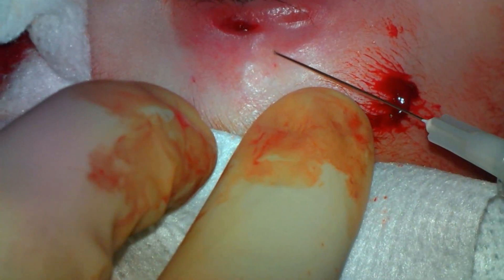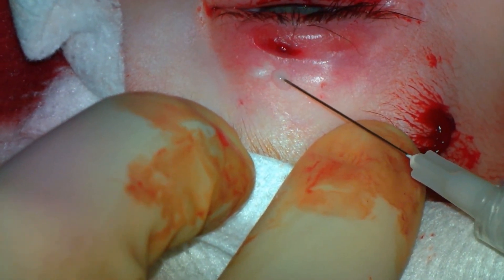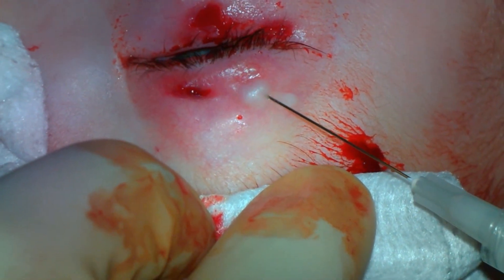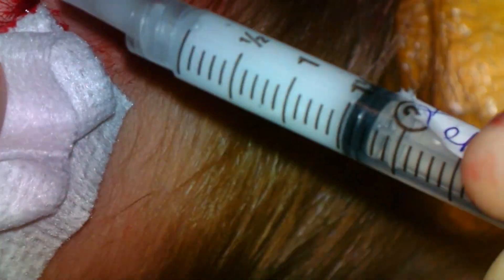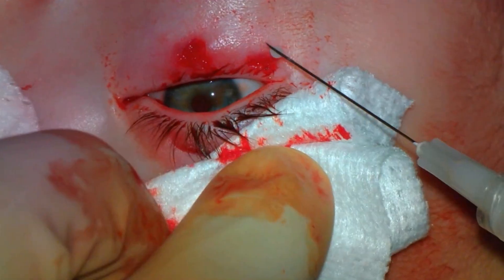In patients with significant disease, I will inject corticosteroid at the same time as the incision and drainage. This is a one-to-one mixture of 40 mg per ml of triamcinolone and 10 mg per ml of dexamethasone. You do not want this injection to be too superficial, as this may leave a white deposit which can take months to resolve.